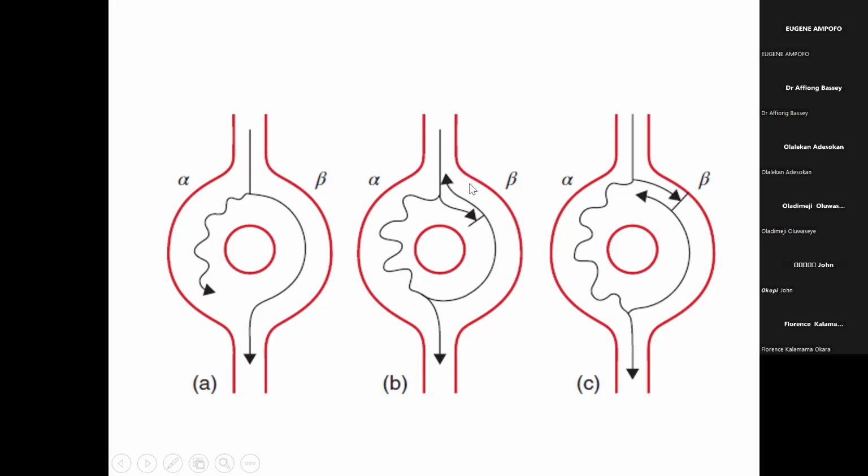So those kinds of patients are the ones that have atypical AV nodal reentrant tachycardia. So anytime you see a patient that has atypical AV nodal reentrant tachycardia, they are going to have a long RP interval, and that means they have a slow pathway.